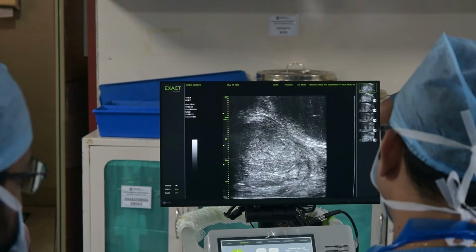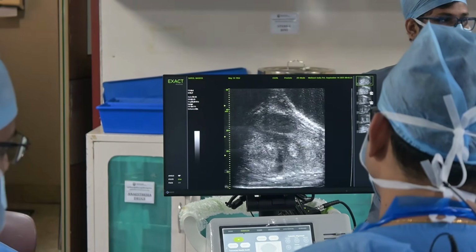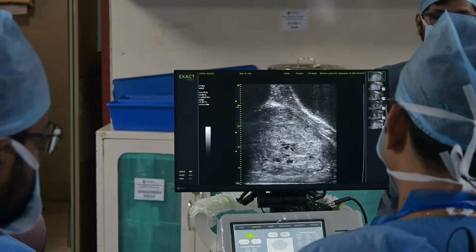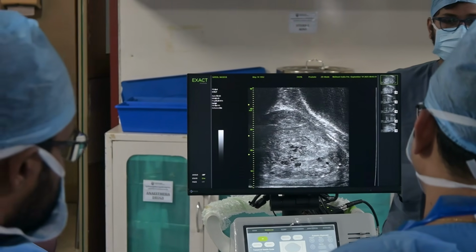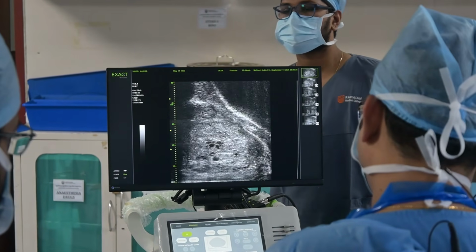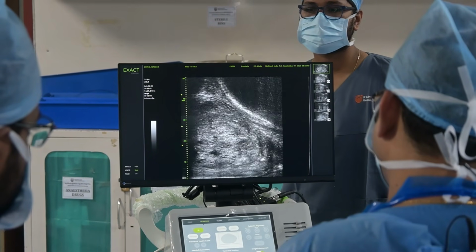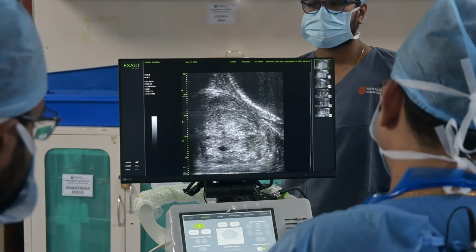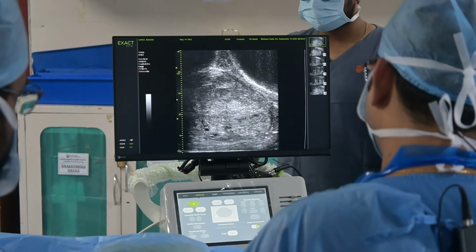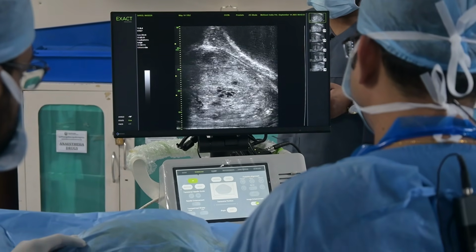And why am I doing this scan? Because the grayscale that you are used to is a smooth grayscale. And I'm sure the audience is wondering what this dirty grayscale has come now, it is of no value. And I realized that the first time you look at this, I also thought that this grayscale is really dirty. And it does not align to our ascribed beliefs at this point.